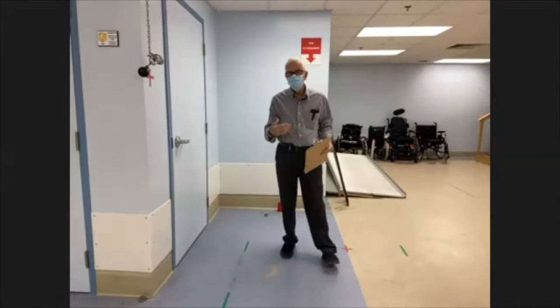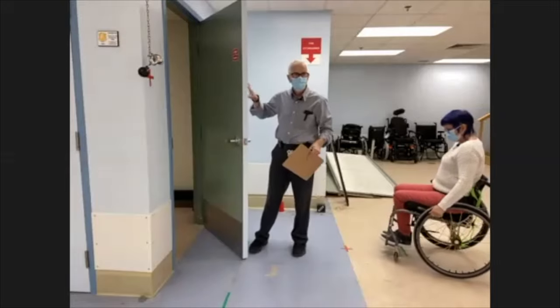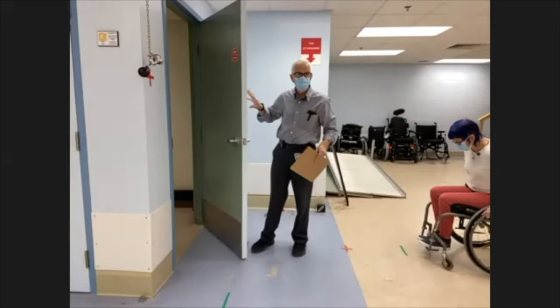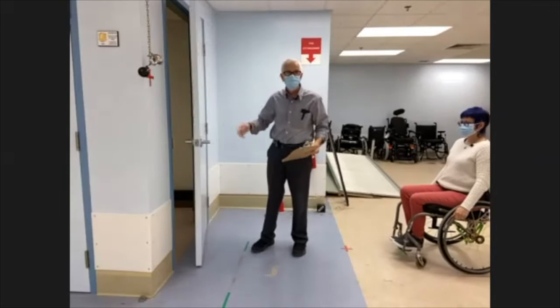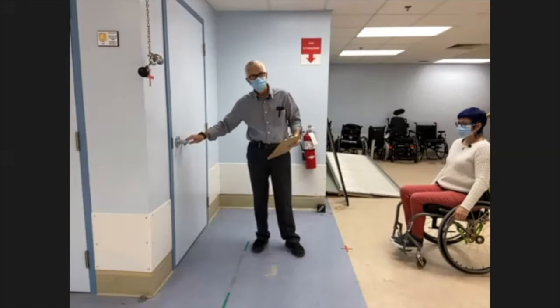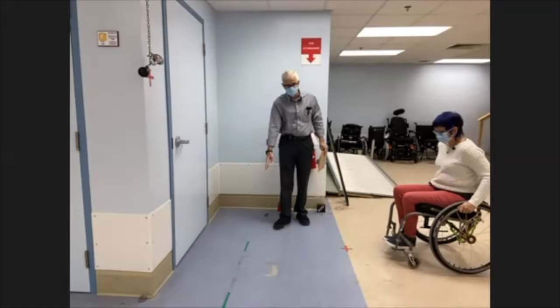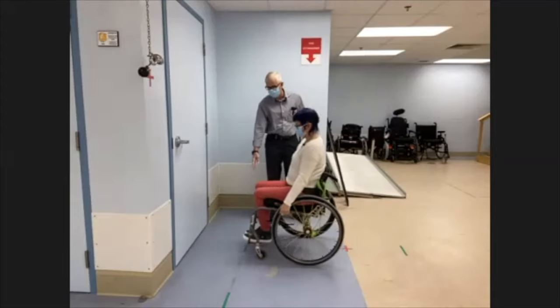The next skill is getting through a hinged door, hinged on the side. There's no resistance to opening and no automatic closing for the door used in the wheelchair skills test. We have a lever handle at the usual height above the floor. The starting position is in front of the door, about half a meter away, just behind the green line.